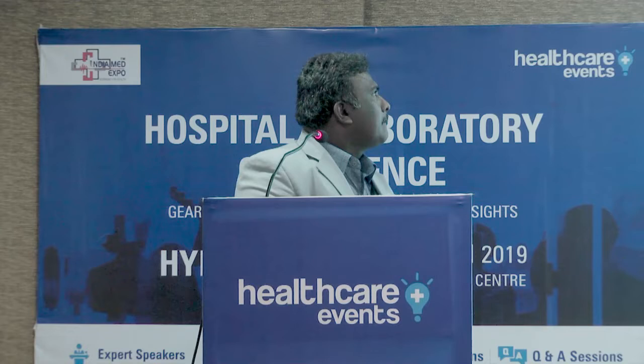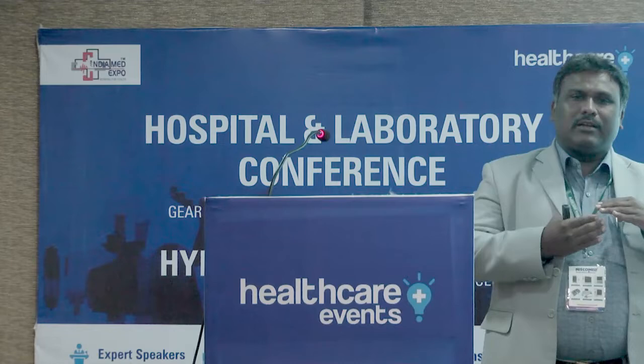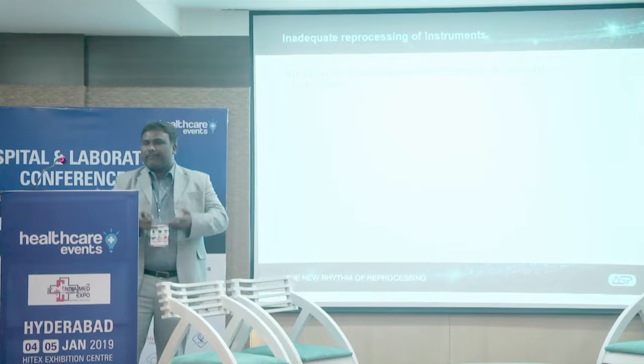What happens if we don't do it properly? There is biofilm formation during the reprocessing phase, happening on the outer surface of the instrument. Once biofilm is formed on the instrument surface, the bacteria within the biofilm are very difficult to kill and have strong resistance. Everybody knows that because we are in the healthcare segment.